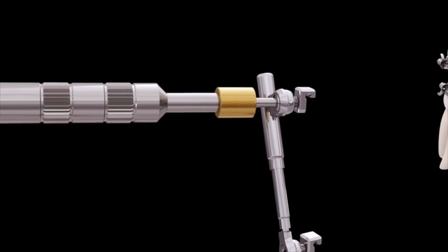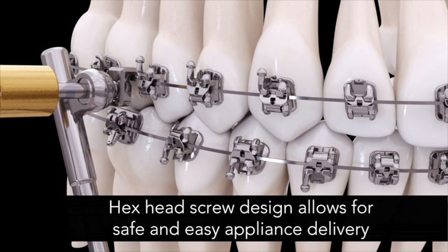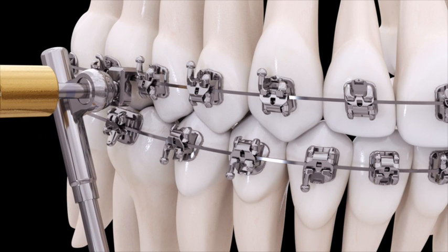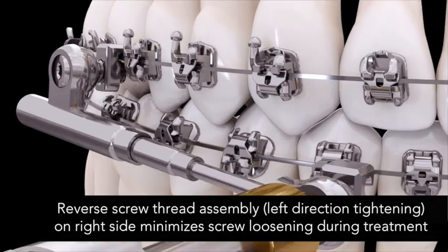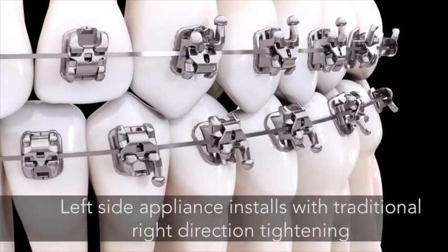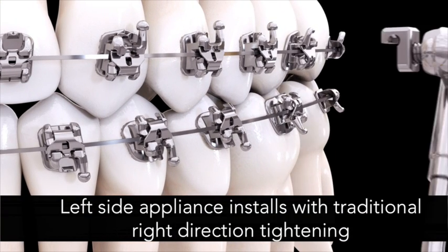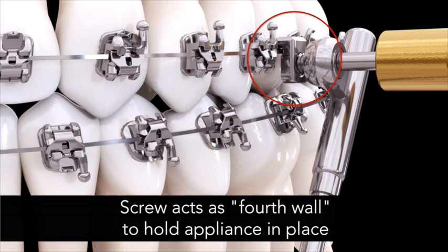Appliance delivery is safe and easy with PowerScope's hex head screw design, and the appliance uses a simple wire-to-wire installation. Screw loosening during treatment is minimized thanks to a reverse screw thread assembly used on the right-side appliance — the device tightens by turning the screw to the left instead of the right. The left-side appliance installs with a traditional right-hand direction. You can see PowerScope's wire attachment nuts hang on the arch wire, and the screw in turn acts as a fourth wall to hold the appliance in place.